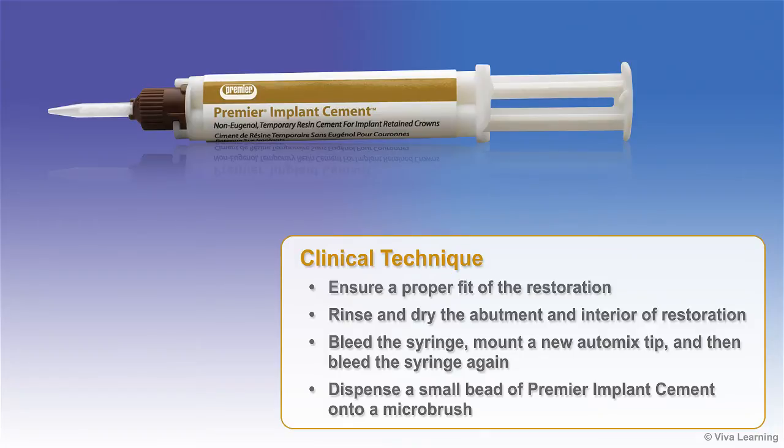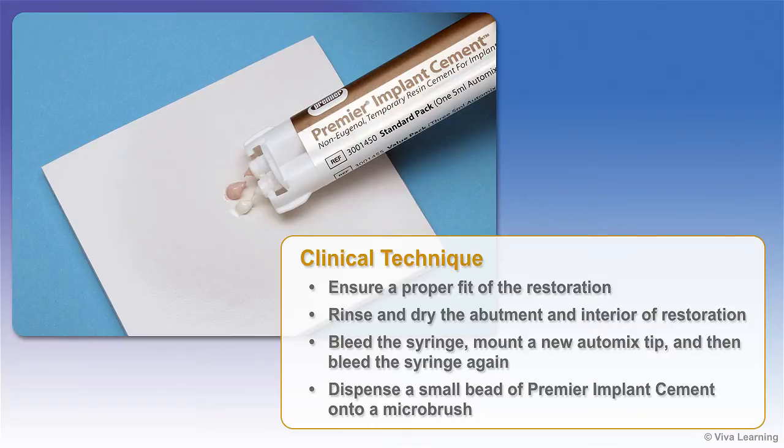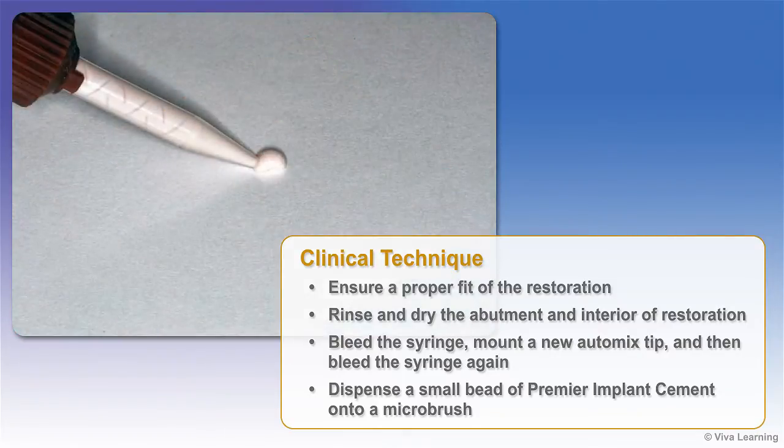Before using Premier Implant Cement, ensure a proper fit of the restoration and then rinse and dry the abutment and interior of the restoration. Next, bleed the syringe, mount a new automix tip, and then bleed the syringe again. This ensures proper flow of the base and catalyst.